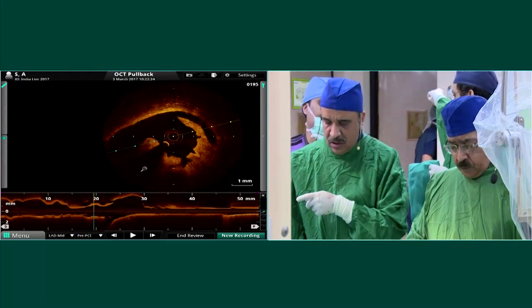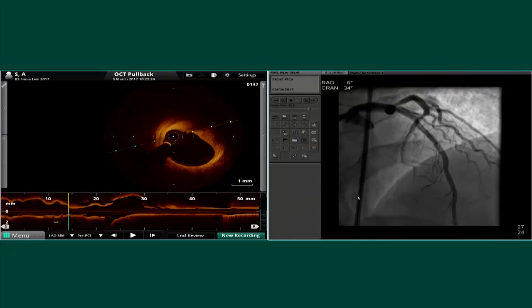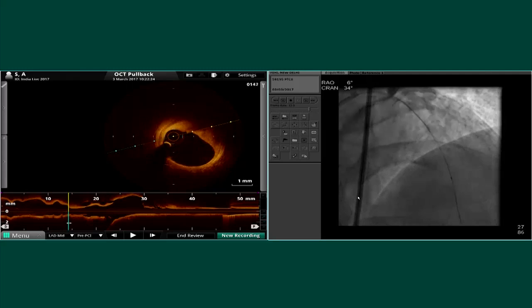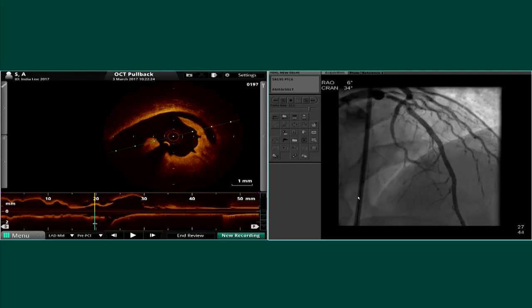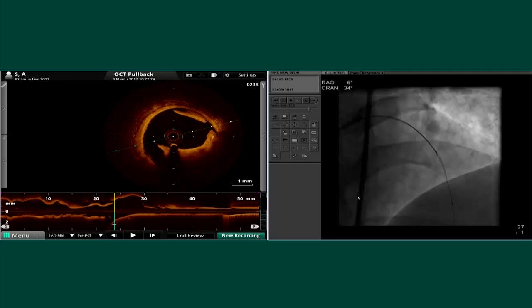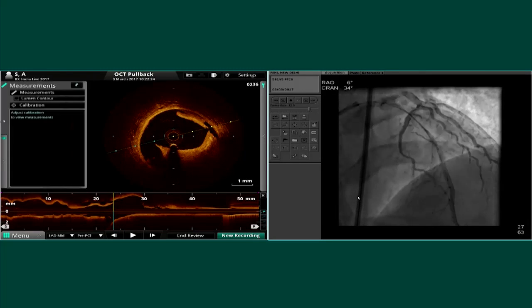And then from distal, you can already see here the extensive dissection of the cutting balloon. So this is a very nice landing zone, 3-layered appearance. And here already starts the dissection. This is a side branch coming in. Where's the side branch?